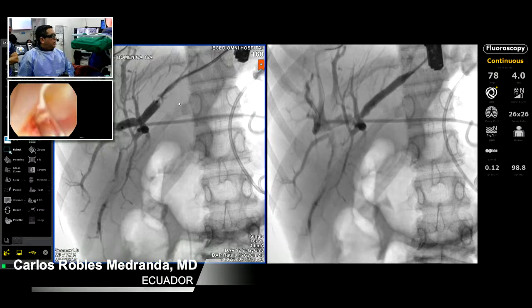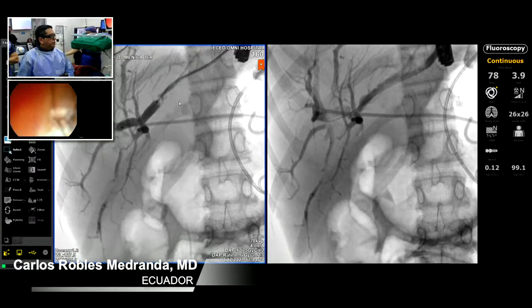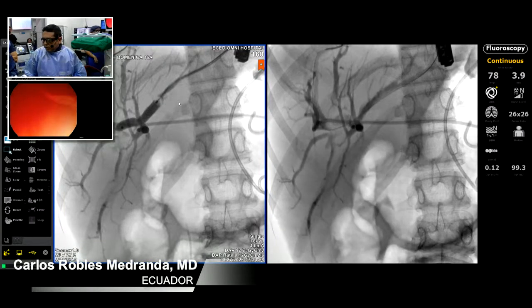Perfect. Perfecto. Excellent. So I will use a 7 French 15 centimeter stent.